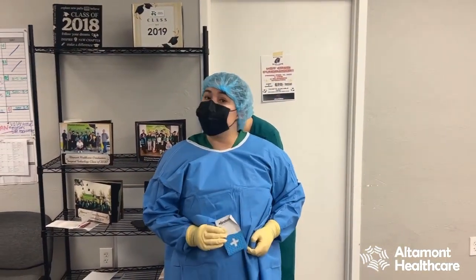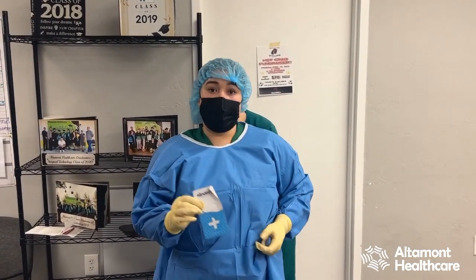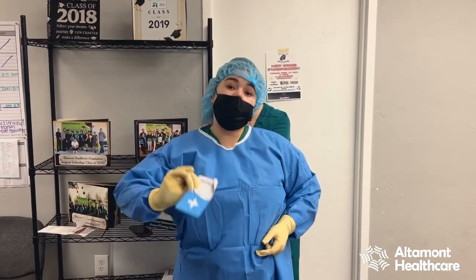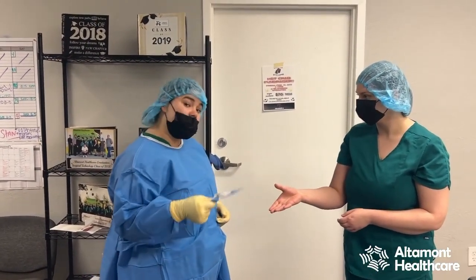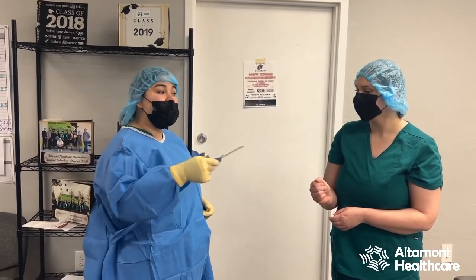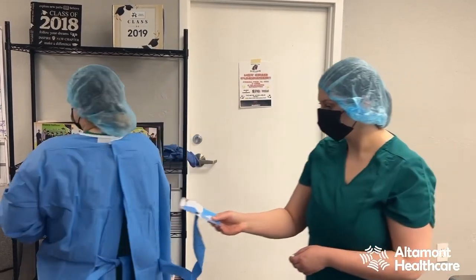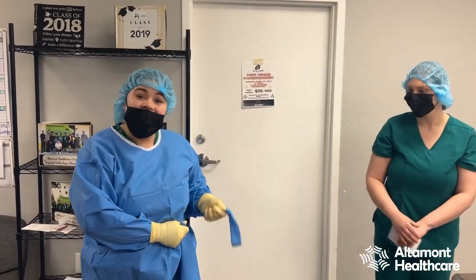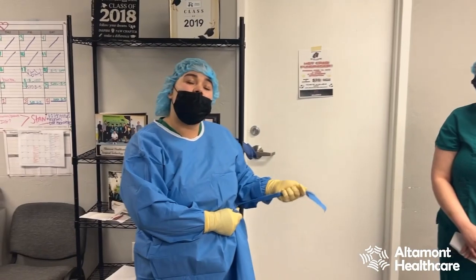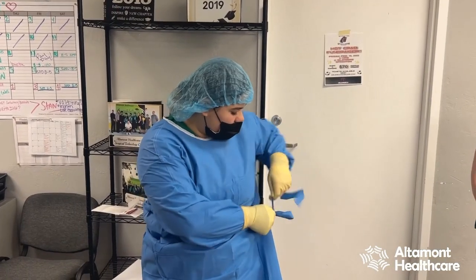Now once I'm gowned and gloved, I'm not quite ready to step up to my sterile field. I have this tab here, and in order for me to be completely confined I'll need someone to spin me. My assistant will be spinning me, so I'm going to hand her this tab — she's not sterile, so we want to be careful. She's going to grab one end away from me, I'm going to spin, and I'm going to grab it closest to me so we're sure not to touch each other. If my glove were to touch her, since she's not sterile, I would have contaminated. So now I'm going to tie this down and I'm ready to go up to the field.